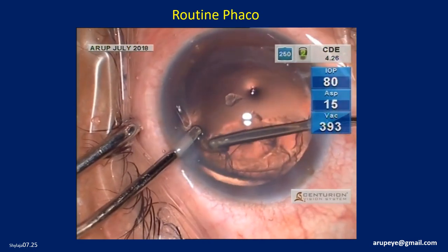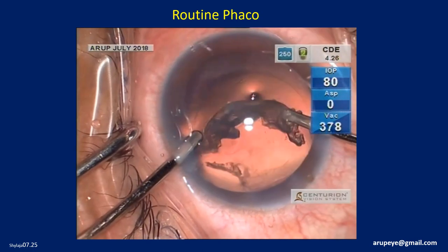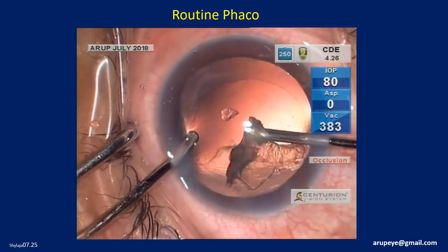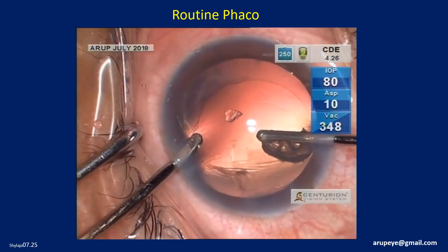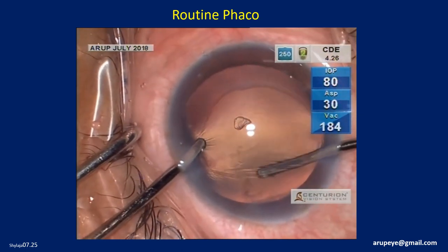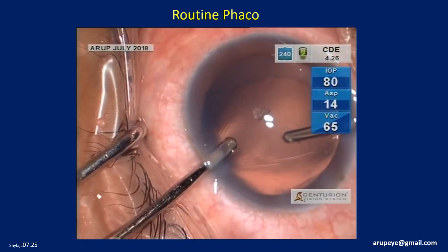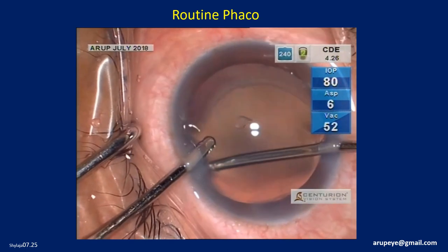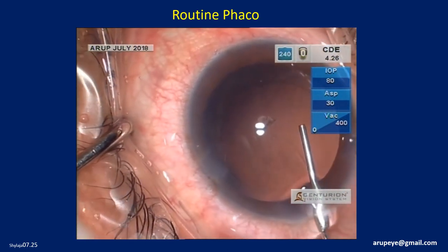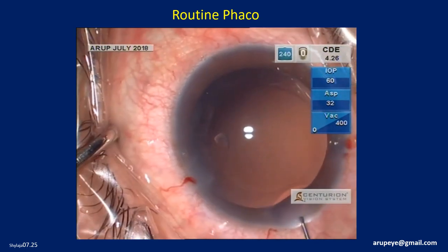Once the cortical material and all the fibers are completely removed, the bag is partially filled with a cohesive OVD. Residual posterior capsular cellular component is polished. I do not routinely polish the undersurface of the anterior capsule. The anterior chamber is again deepened with a cohesive OVD.